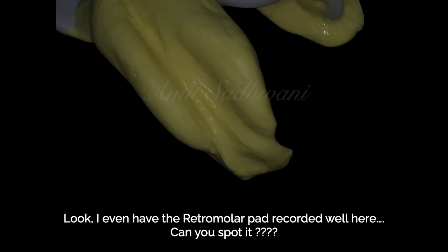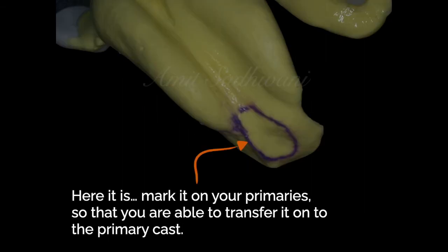If you carefully see, one of the most vital anatomical landmarks is the retromolar pad, and I have recorded it well in this case. Are you able to see it? Here it is. So you need to mark the vital anatomical landmarks onto your primaries so that you are able to transfer them onto your primary cast.